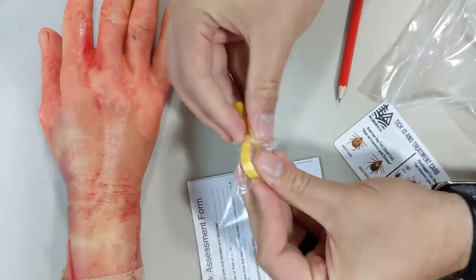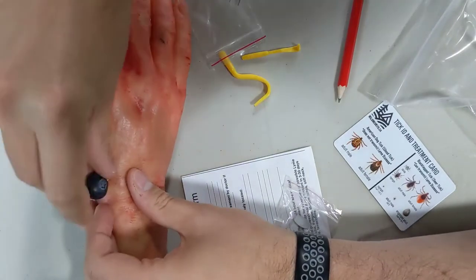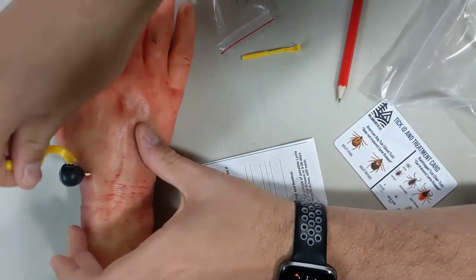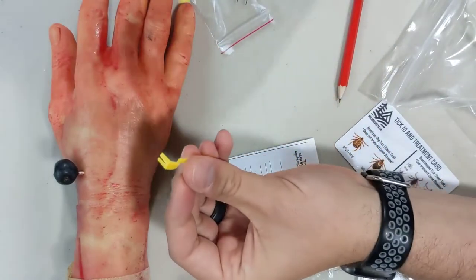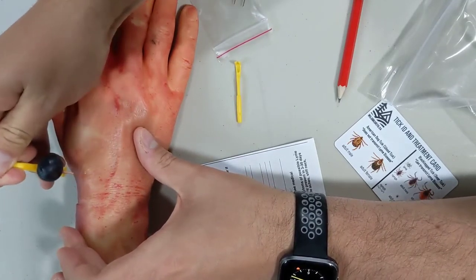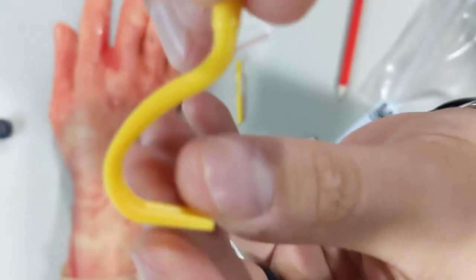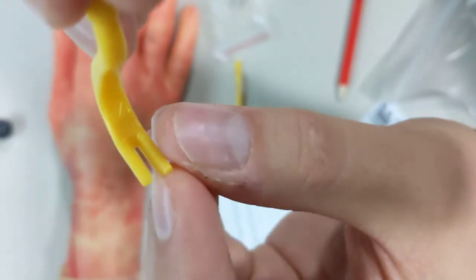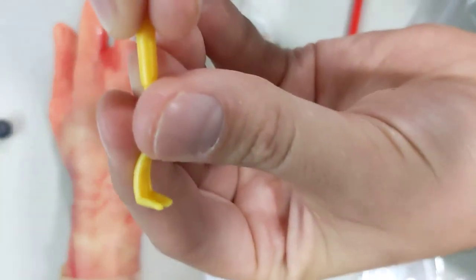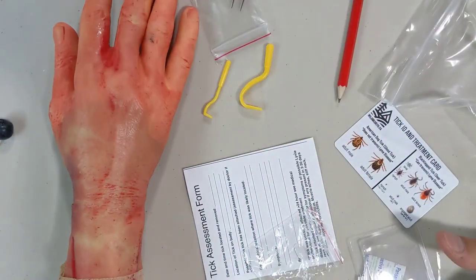For the tick tools, here's a demonstration using the fake tick again. The tick tools work similarly — there's a smaller one for really small ticks and a slightly bigger one for larger ticks. You slide it in underneath and use it to steadily pull up. They have a nice fine graduated tooth that grasps in under the tick and helps you pry it up. That's the larger tool and the smaller tool — that is our tick kit and how to safely remove ticks.